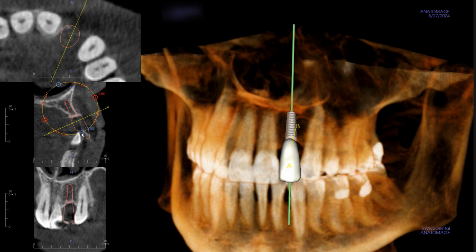So from an implant positioning perspective, in order to try to get this to be screw retained, this is definitely something we can do. We always try to aim for screw retained where we can. Would we be successful here in that? Yes. So I don't think there's too much of an issue with that particular part of the treatment planning. Sometimes we have to upright the implant in order to get it to come through the lingual, and in order to do that, we might have to do some grafting here. Fortunately, we're able to avoid that if our main goal is only to put an implant here.